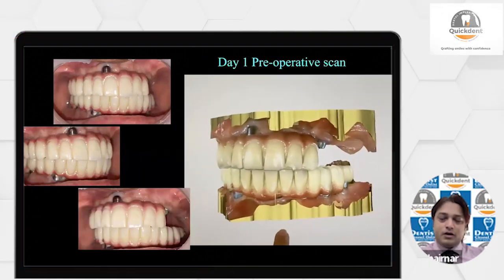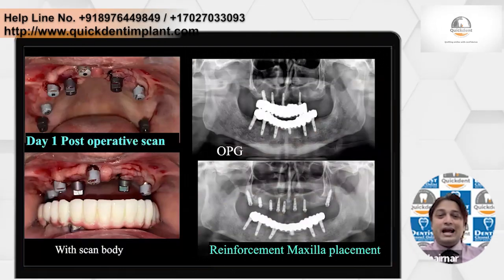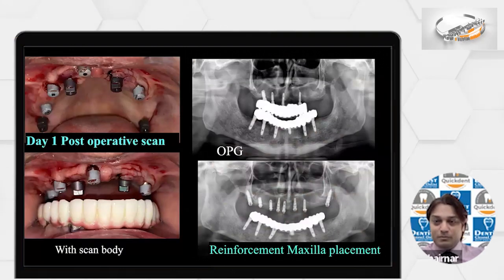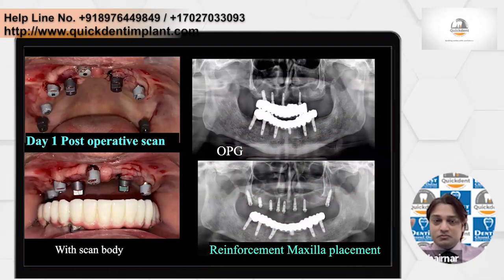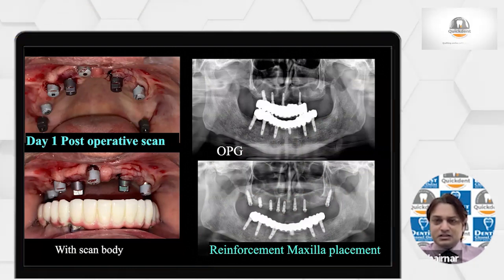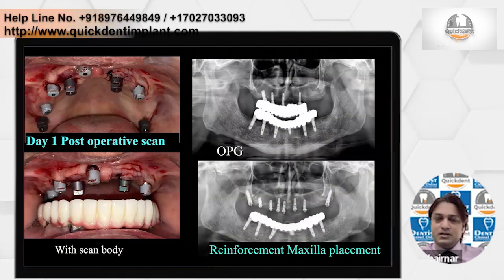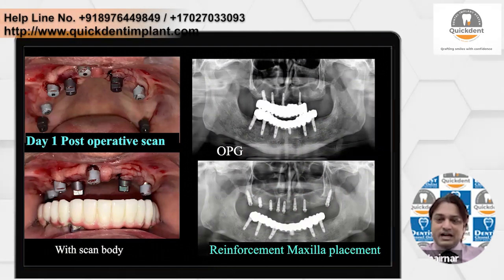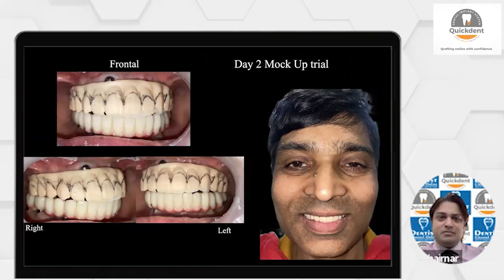Everything is ready. Our record is ready. Our bite is ready. Now we'll take out the prosthesis. We will add more number of implants. Like 4 implants were added in between all these implants, and definitely we gave the pterygoid. Although the pterygoid was very difficult in this case, it was having a decent junction where we could engage the pterygoid. We got a good torque and we placed the pterygoid implants. So we avoided the cantilever. We scanned everything, and we didn't send any physical bite.